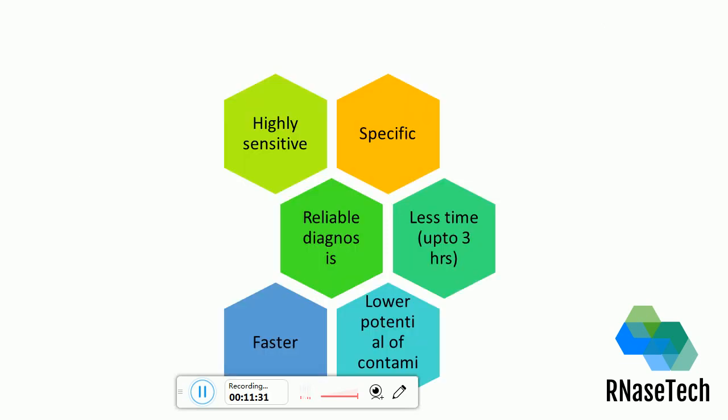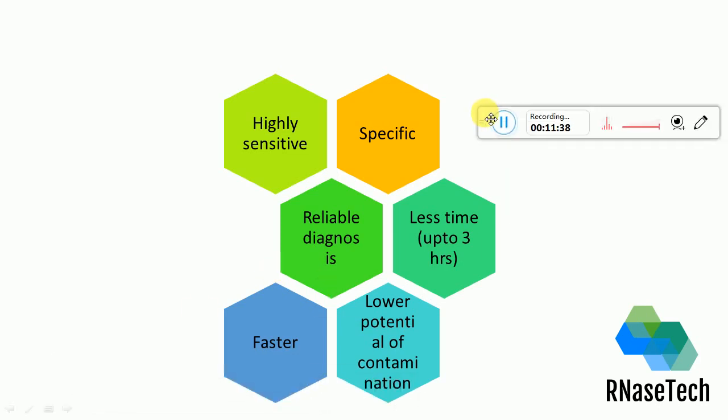So now the next step would be: what are the benefits of using RT-PCR?